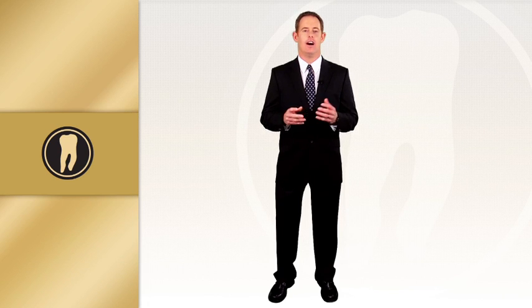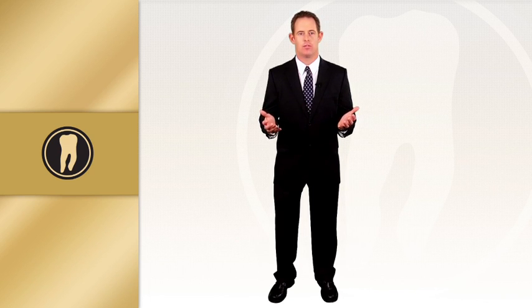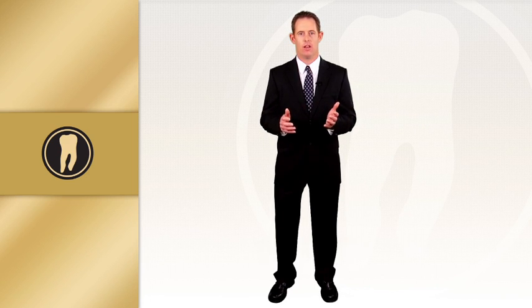Whenever I lecture, I often get asked about the best ways to perform access on teeth. We all know that the access sets the tone for all of the following steps in root canal therapy. Over the course of the next hour or so, we are going to take a deep dive into some of the nuances associated with performing excellent anterior access.